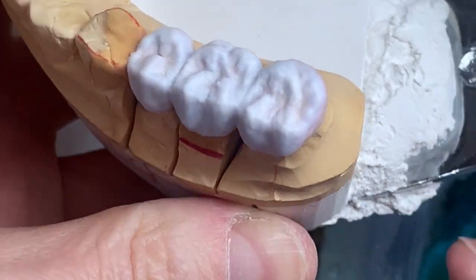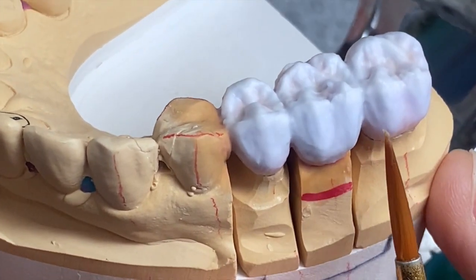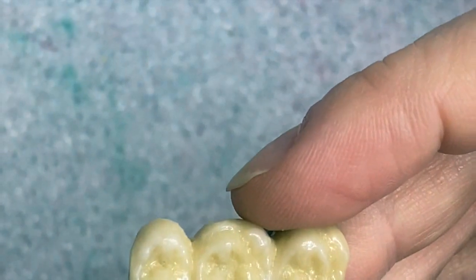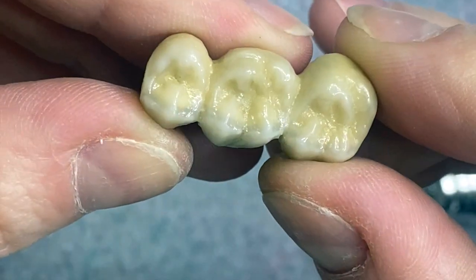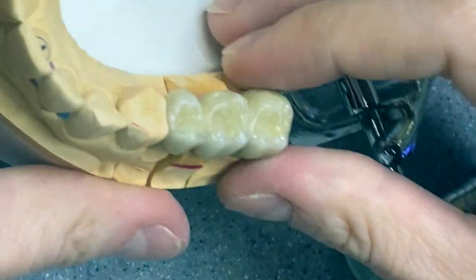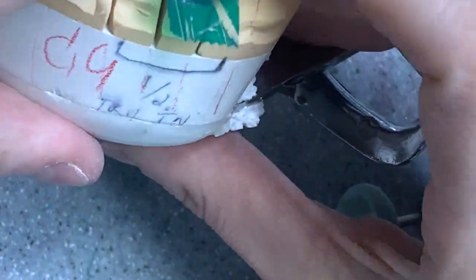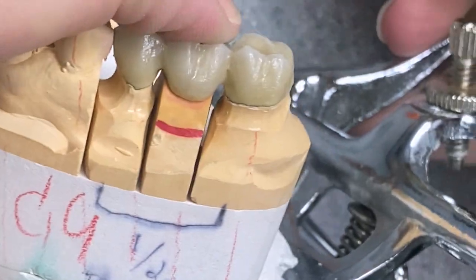Now it's finally ready to go for the bake. I'm gonna put it in the oven now and I'll see you very soon. Okay, so this is what came out of the oven — that's what it looks like after the bake. Let's see how it sits — it's rocking. I'm gonna grind under the pontic. Okay, now it's sitting well.